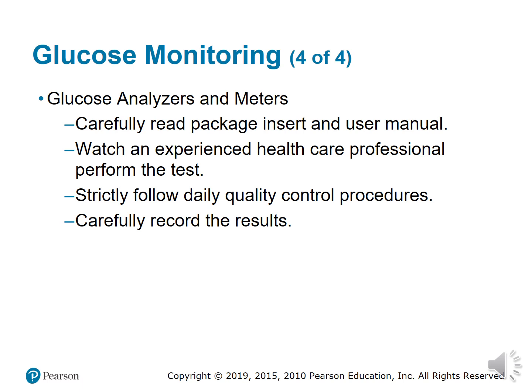With glucose meters or analyzers, you always have to carefully read the package insert and user manual because, like I said, for the Hemocue glucose monitor, as we just displayed, you have to wipe off the first 3 drops. But with a regular glucose strip, you only have to wipe off the first one.